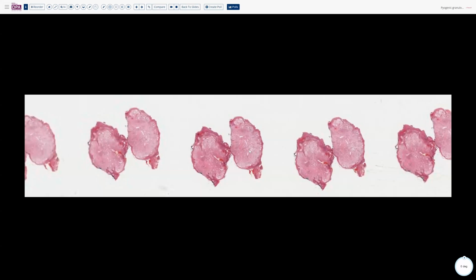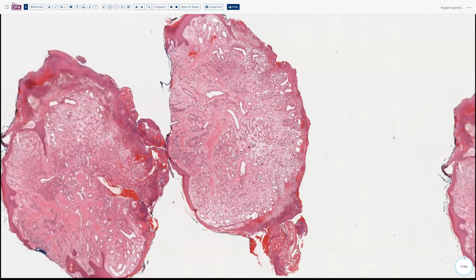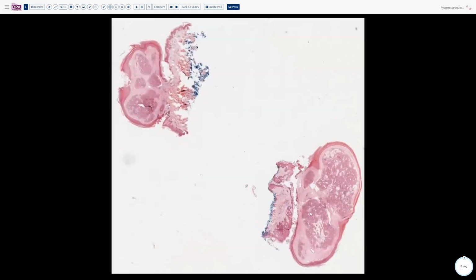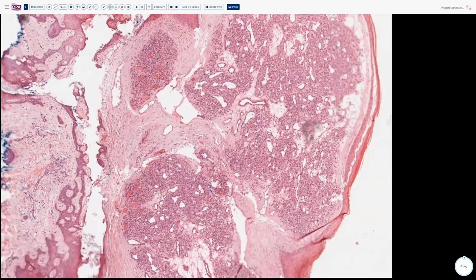Another example, this one again, completely surface epithelium with a small exception. Not quite as prominent, the lobules, but there are some intervening fibrous septae. And then towards the base, you may have these feeder vessels that can be a little bit larger. You would not generally see large dilated vessels superficially, although obviously this one does have an area of ulceration near some larger vessels. And another example, again, a nice little collarette and lobulated structures, dilated spaces, some more solid areas.